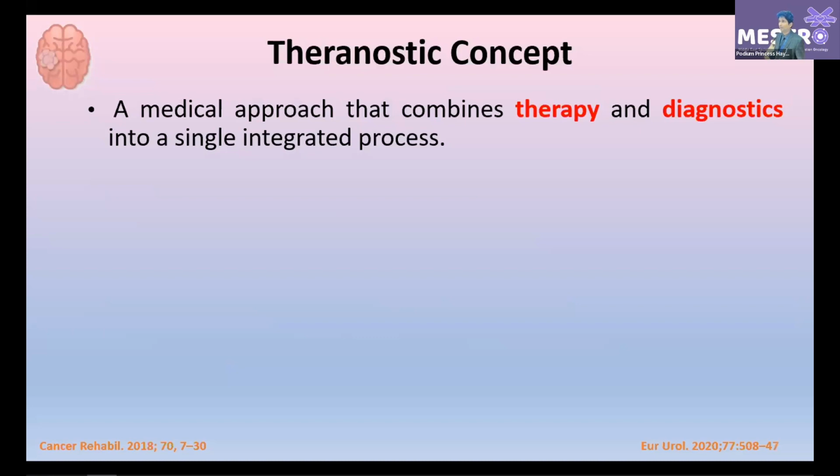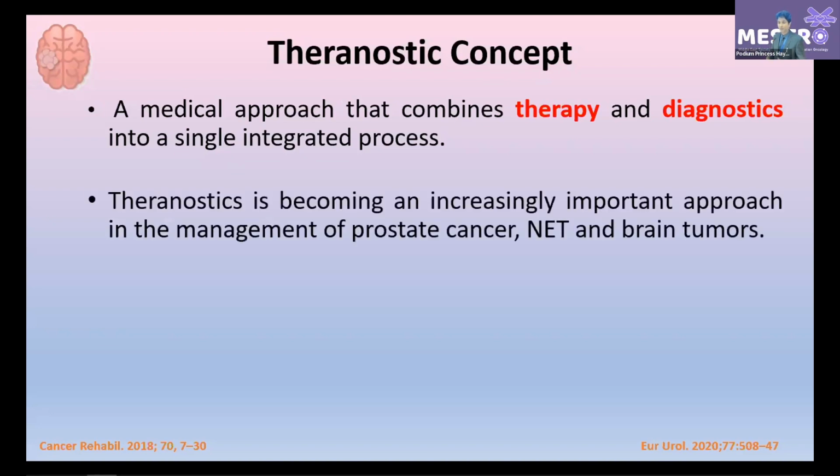So what is the theranostic approach? That means combining the therapy and the imaging part in a single integrated process. So you will image the patient and see the tumor pattern, and you can treat the patient. And this theranostic approach has become very interesting for the management of prostate cancer, especially neuroendocrine tumors as well, and the brain tumors.